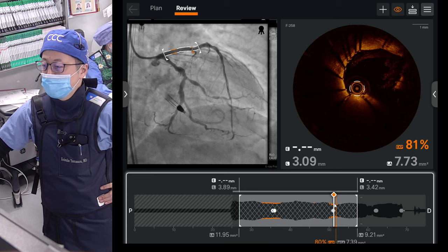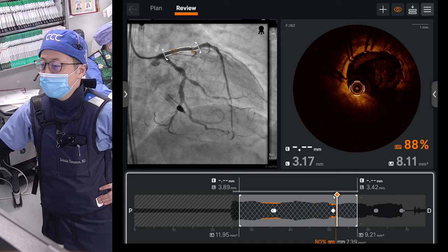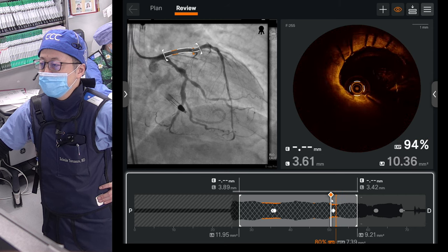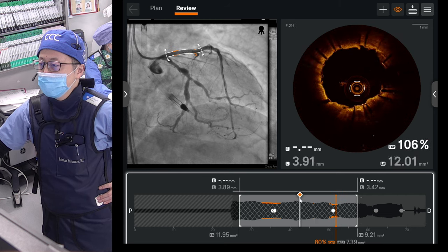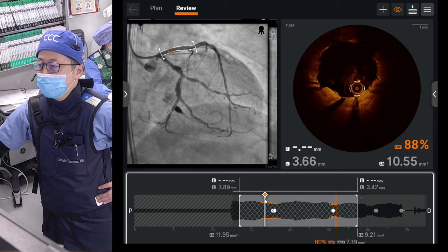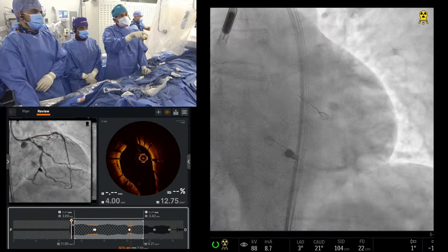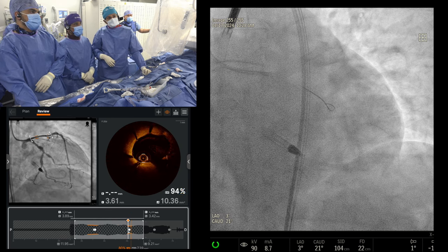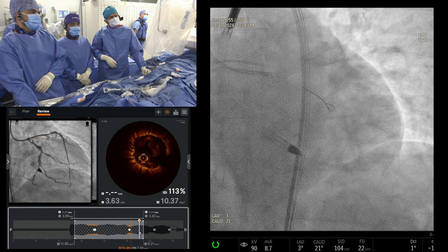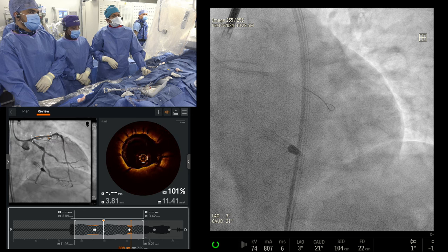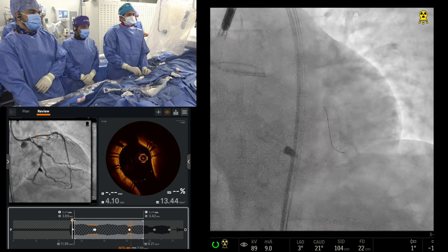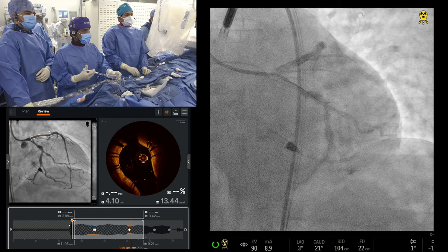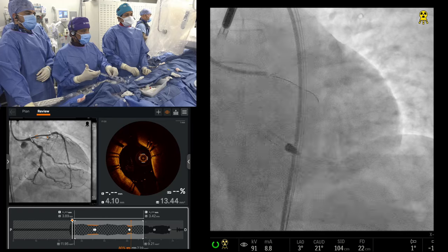No malaposition, no dissection — it's a perfect result. We did post-dilate, which is why it looks good. I would agree: routinely post-dilate unless you do OCT after placing the stent first and see you don't need to. About 60% of stents are under-expanded — you can't tell angiographically. Either routinely post-dilate or serially image. That looks terrific. You don't worry about covering the circumflex a little bit — you can see the circumflex was wide open, plenty of access.